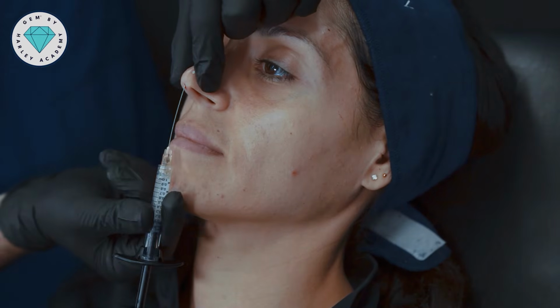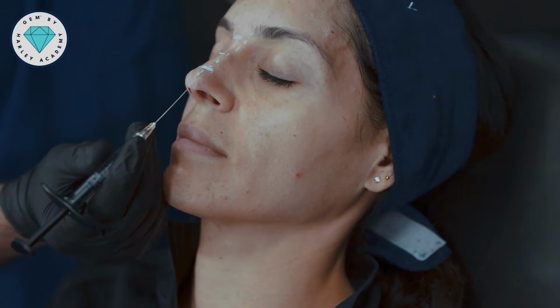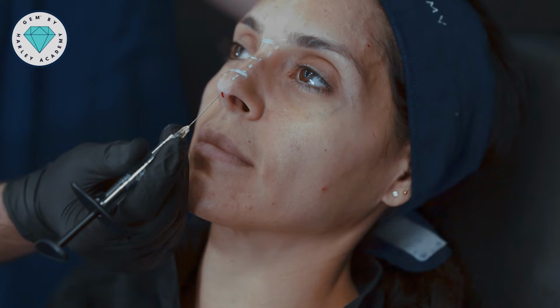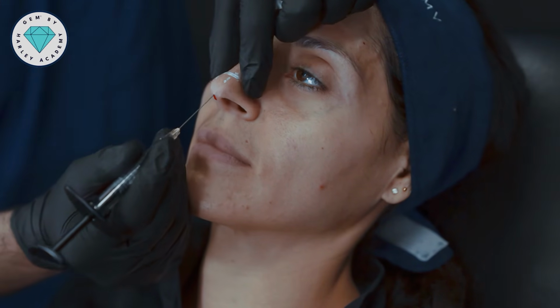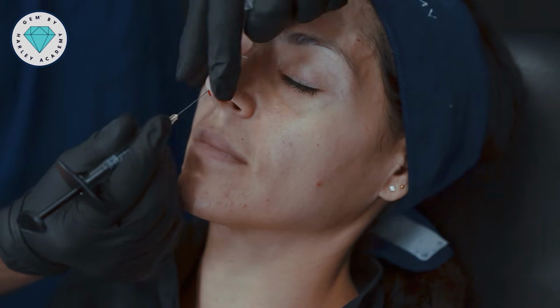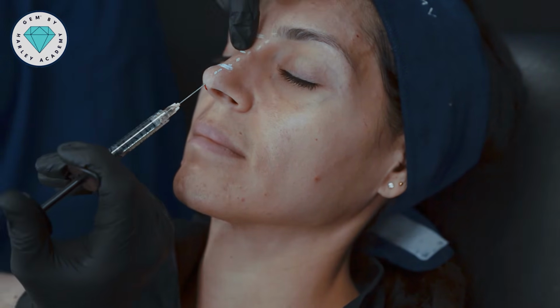And then I move from the tip onto the nose dorsum like this. And you can find that resistance. That resistance here is showing me that I'm now at the point where we have the start of the 5 layers of the face. And I'm going to push through, staying in layer 4 of the nose, gliding along the perichondrium in this case, as I make my way up the midline.